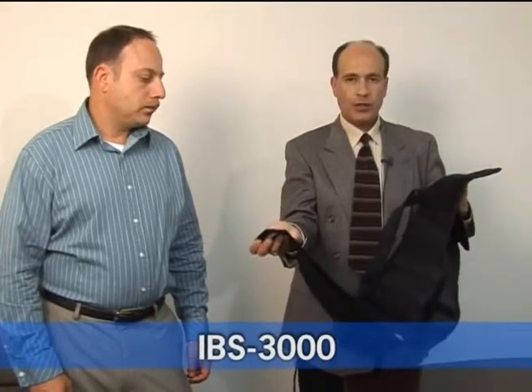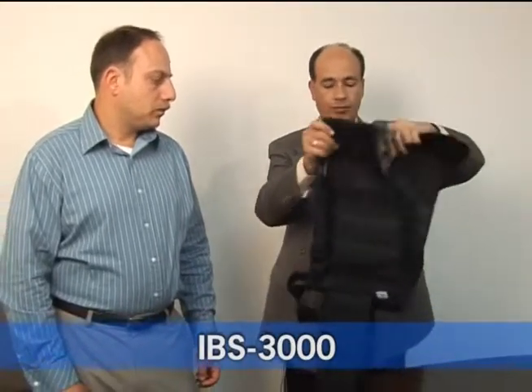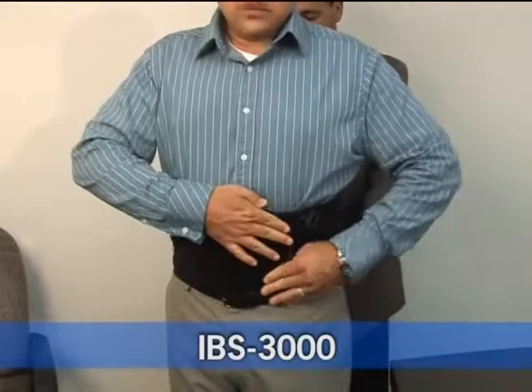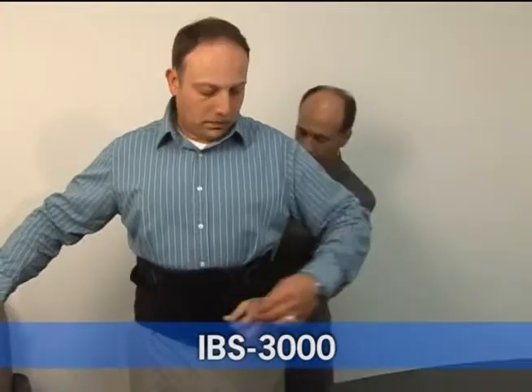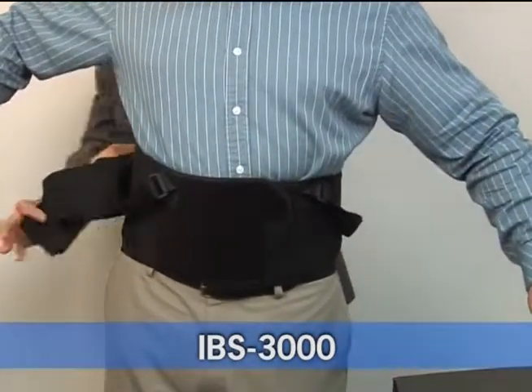They're great for lifting and moving heavy objects. To use the belt, attach the extra pulls, adjust the front strap, wrap around waist, and adjust accordingly.